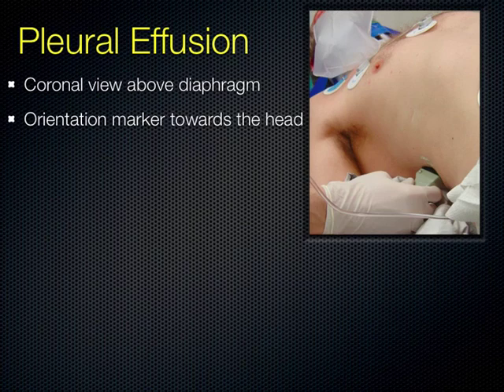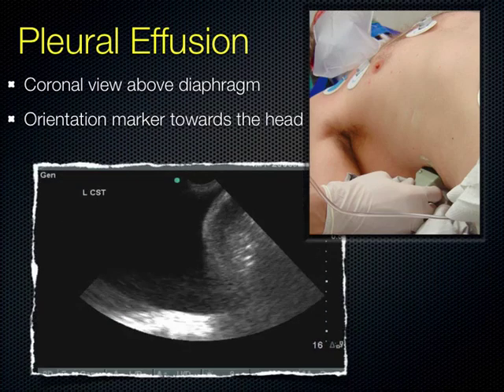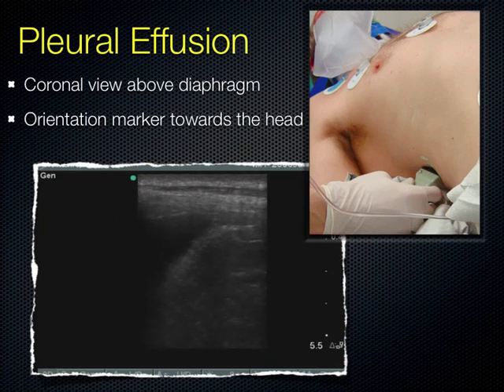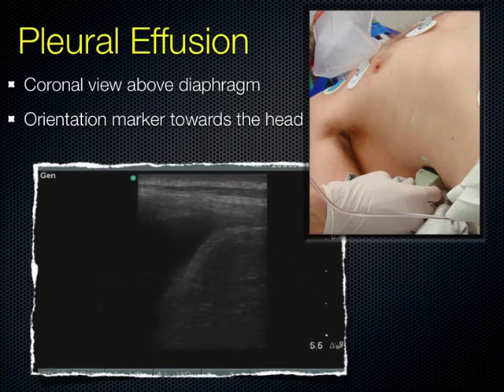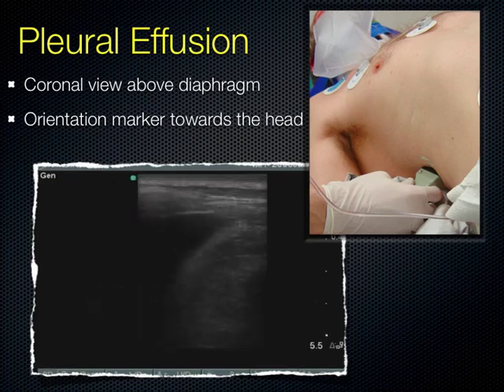Diaphragm, pretty clear, and right above that, if you see blackness, what is black? What? Fluid, right. What does air look like in ultrasound? Air doesn't look white. Air, you can't see air. Air just scatters the picture, right? Air doesn't conduct ultrasound well. So basically, if you have air, kind of picture.